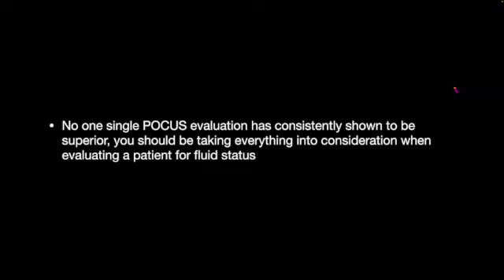And in fluid status, that is no different. There is no single point-of-care ultrasound evaluation that's going to be better than another, okay? So you should be looking at multiple regions on your patient, multiple organs, and considering all of that when assessing and making the decision to administer more fluids.